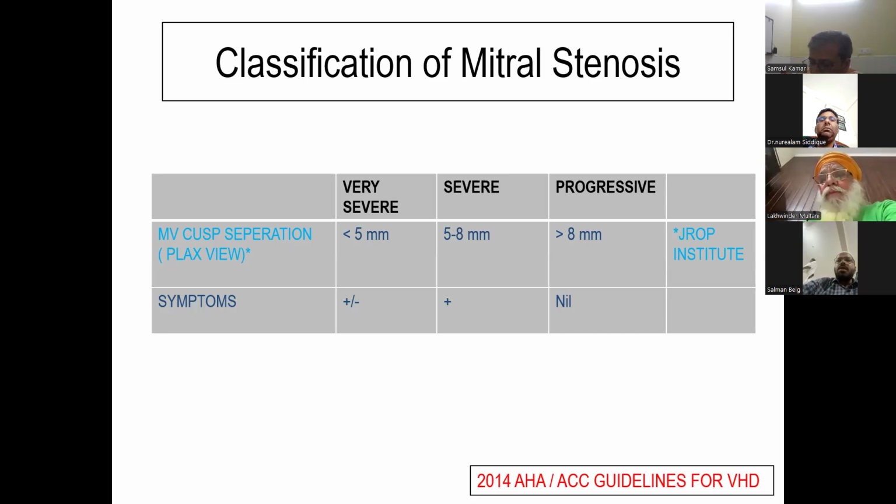So your question is very true. When do we do it? Virtually, when I have to give an answer that this patient needs a valve intervention, I'll do it in virtually every subject. If you happen to come to my lab, if I get a mitral stenosis, I'll take about 30 to 45 minutes.